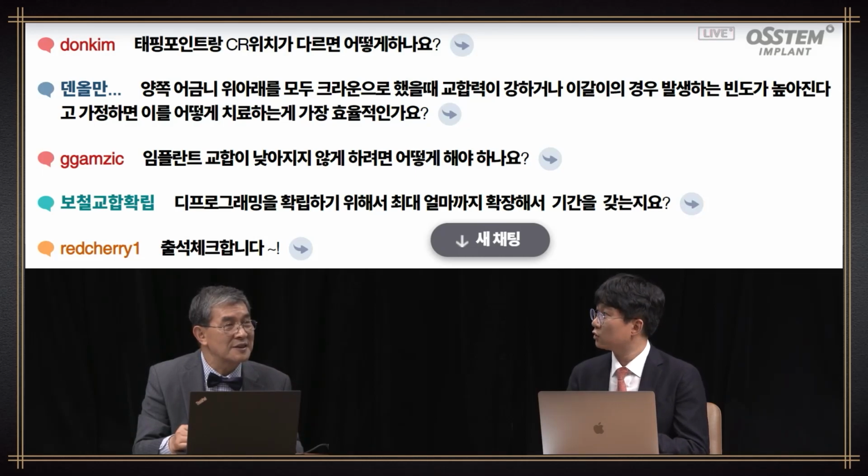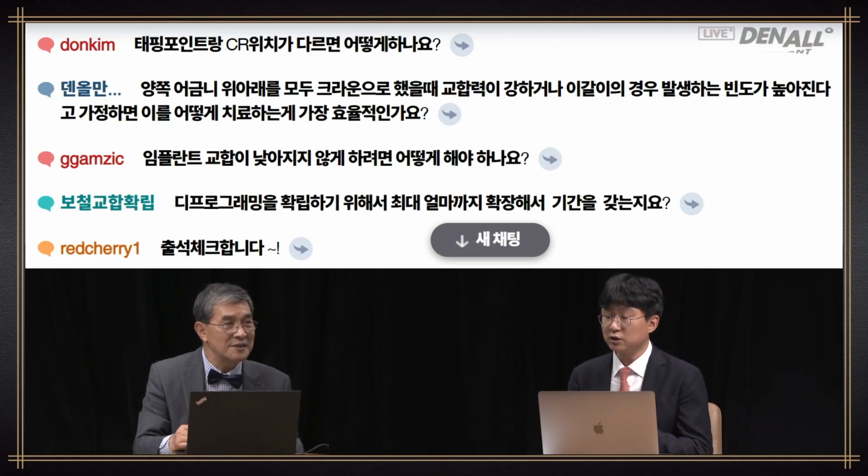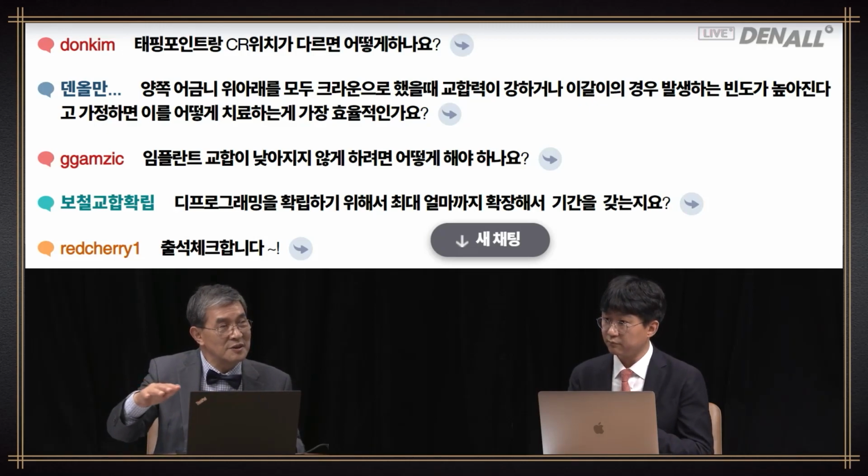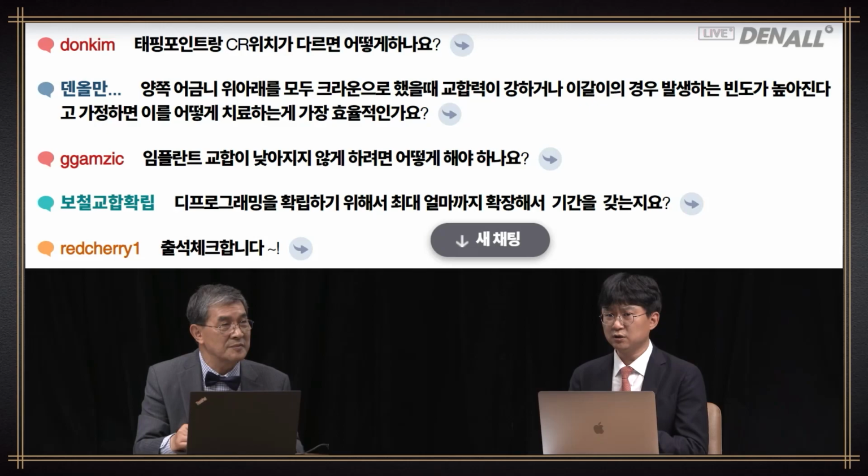When the difference is huge and some patients cannot chew with the position we guided, we have to use the tapping point. If we have to fabricate the denture immediately, if we have time, we can use a treatment denture to make backward movement. We cannot always afford to fabricate two dentures. In such cases, I do not use the anatomic teeth, but use the lingualized occlusion with a little bit of freedom. That makes occlusal adjustment a little bit easy.